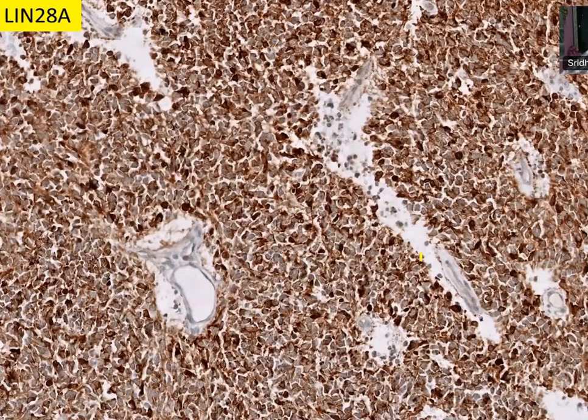What is Lin28 here? Sir, there is a diffuse cytoplasmic positivity. So what does it tell us? Diffuse strong positivity of Lin28 is a surrogate marker for embryonal tumor with multilayered rosettes. Most of the time when it is positive, it corroborates with C19MC amplification. C stands for chromosome, 19 is numerical. Chromosome 19 microRNA complex amplification can be detected by FISH.